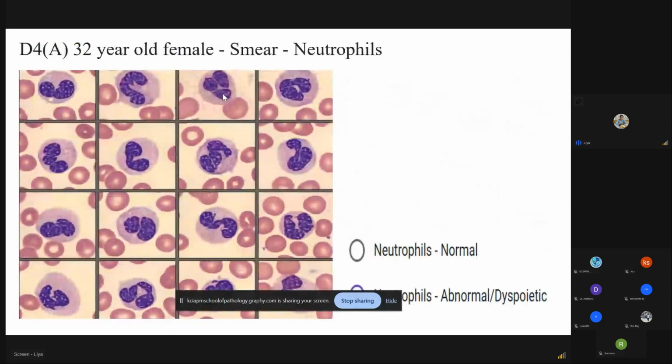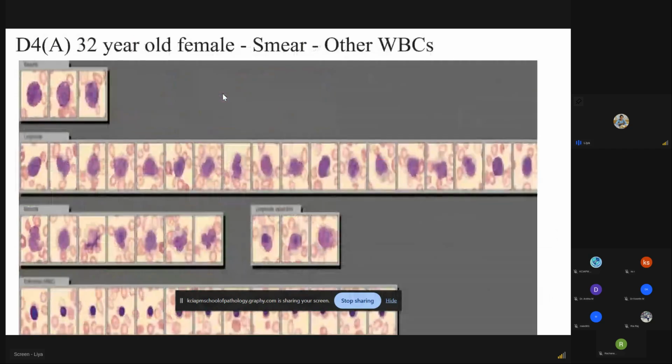The neutrophils show dysgranulopoietic changes of hypogranulation and hypolobated neutrophils. Basophilia, 3 basophils were noted, and under lymphocytes, reactive or atypical cells were seen, the majority of which were monocytoid forms, and 13 NRBCs seen.